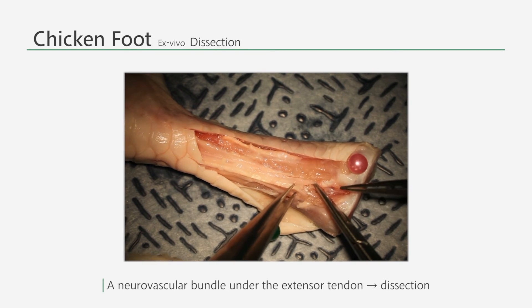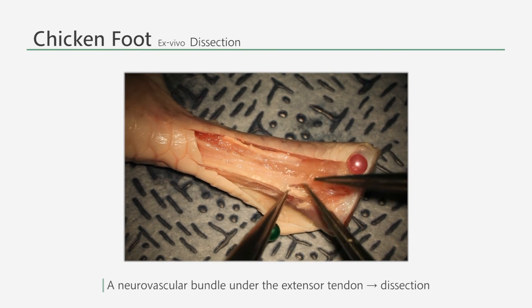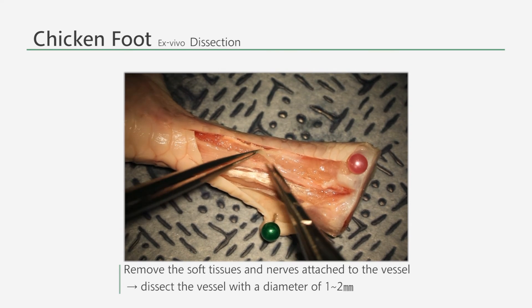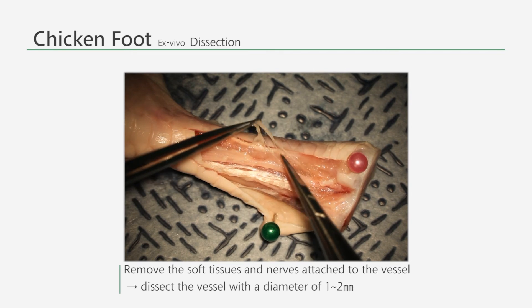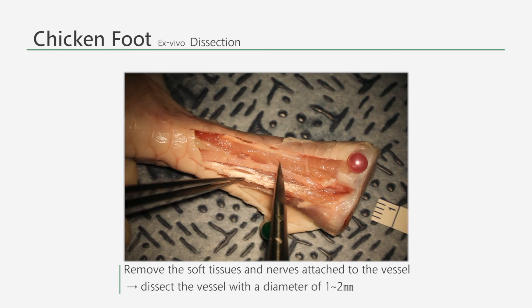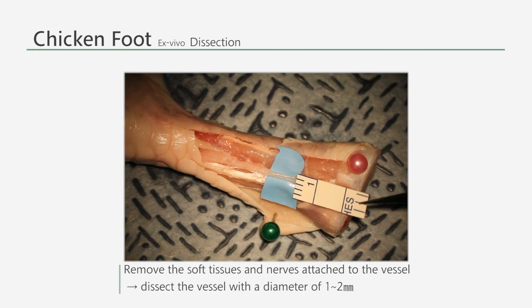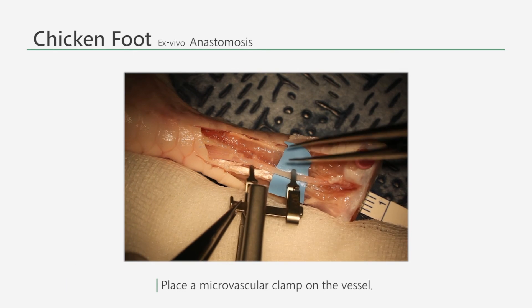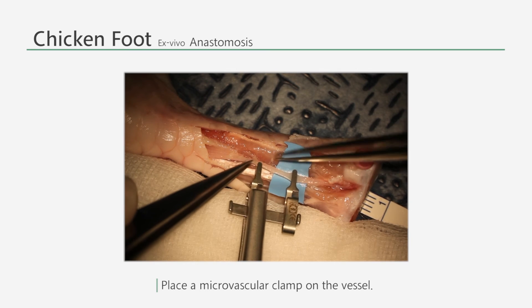Use the adventitious scissors to remove the nerves attached to the vessels. Once you also remove the soft tissues attached to the vessel, you will be able to detach the vessels with diameters approximately 1 to 2 millimeters. For the convenience of the surgeon, a piece of background material can be used to separate the surrounding tissues from the vessel.